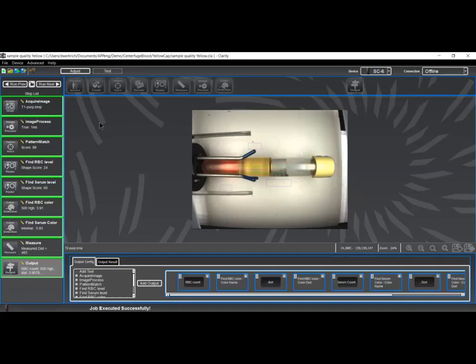I've jumped into the whole operational script now just to give an overview of the uses of the different features and the different processing here. We have the acquired image process, which I mentioned already. We are anchoring some of our processing to a feature on the test tube, so we have a pattern match process. We are finding edges, liquid levels, using an edge finding process in two places. And finally, we are looking at some color measurements in various zones, the red blood cell and the serum zone.